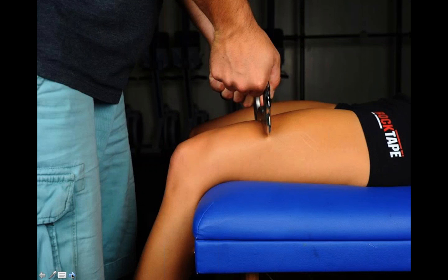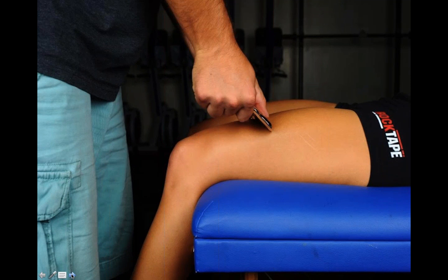Really quickly, again, less is more, and that's what we're trying to convey with the population out there, as far as the sports medicine population and its associations. So a 90-degree push on a thigh is very direct and pretty hard. Here's 45 degrees.